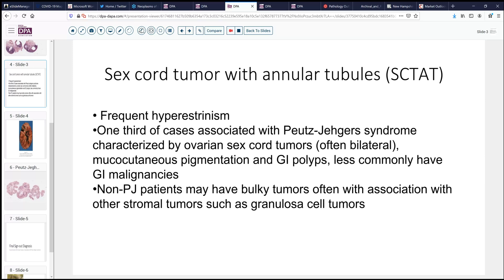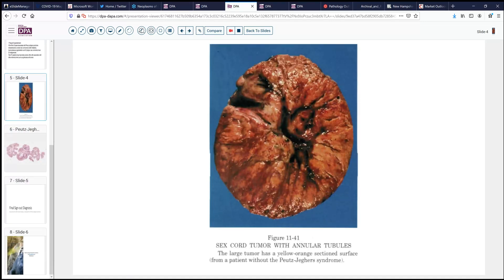Less frequently, these patients will develop GI malignancies. The non-Peutz-Jeghers patients may also have hyperestrogenism, but their tumors are usually a bit more bulky and may be associated with other stromal tumors such as granulosa cell tumor. We'll look at one such gross example here, courtesy of the old AFIP fascicles by Drs. Young and Scully. As you can see, this has the appearance of a fleshy tumor, mostly solid, with a very friable type of parenchyma with areas of hemorrhage — a very cellular tumor with not much stroma.